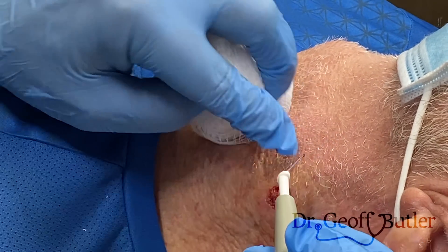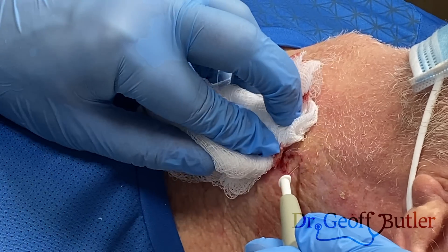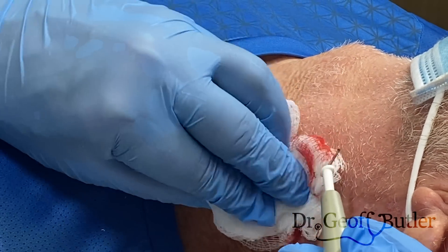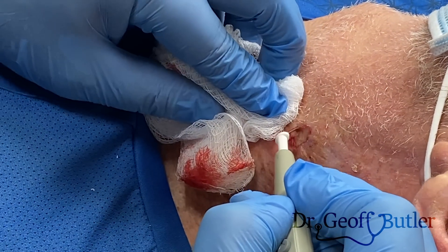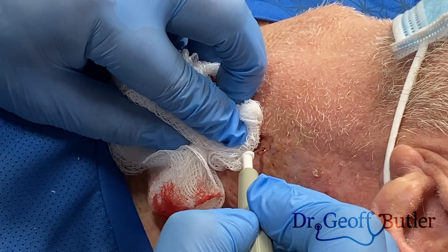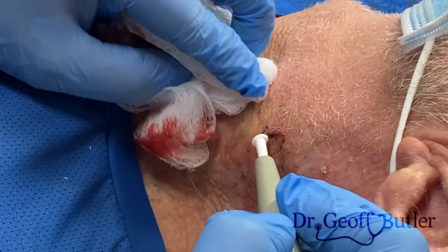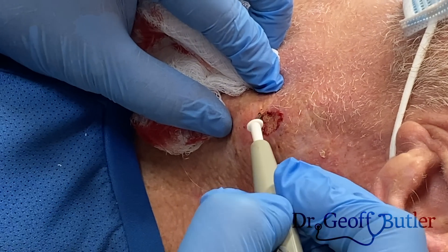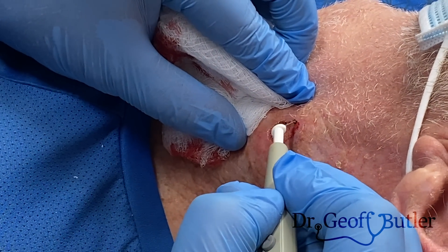I'll turn this down a little bit. If you've never used a hyfrecator before — if there's too much fluid underneath it, it won't conduct the electricity. So if it's too wet, it won't work. You have to make sure — that's why you sometimes see me putting pressure on it, and then right when I'm beyond it, I actually apply it. Because if I let it accumulate too much, that's not going to do enough. If it's bleeding too much, the cautery just won't take.